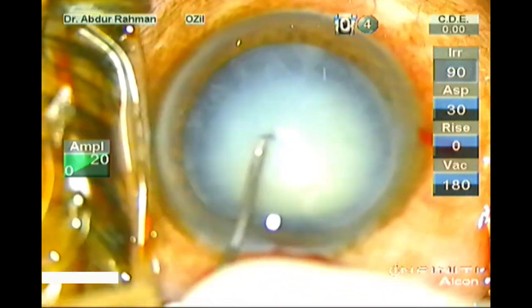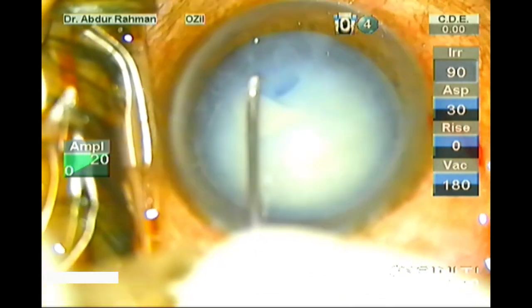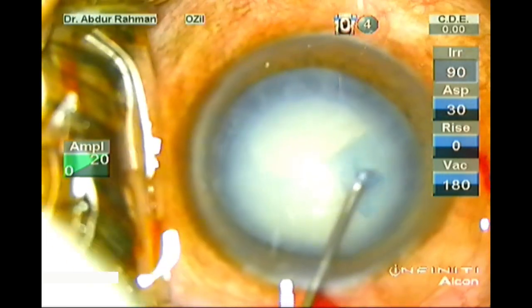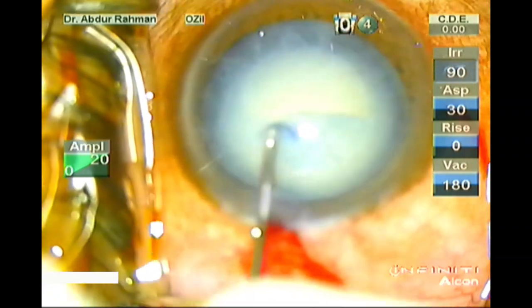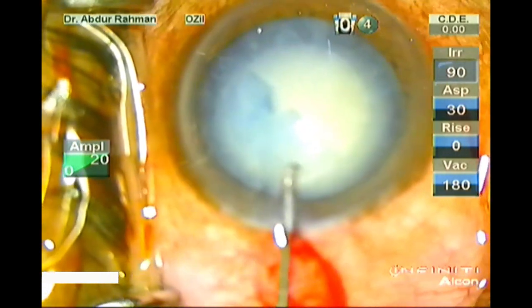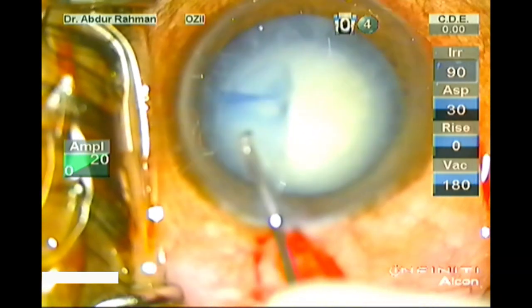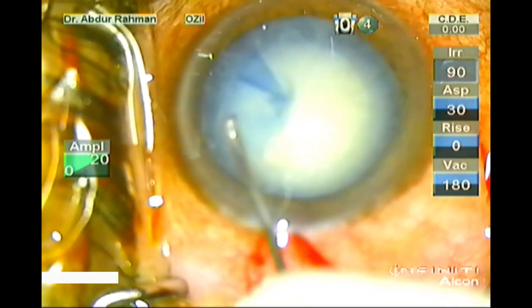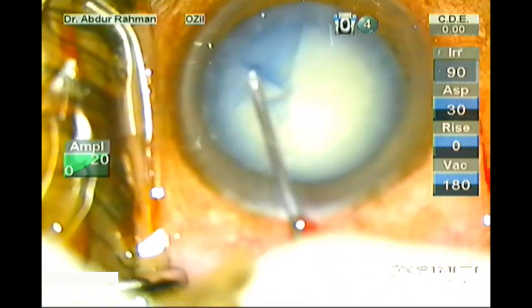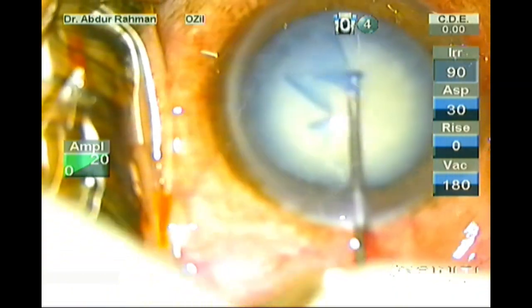Now commence with the creation of a continuous curvilinear capsulorrhexis of 5.5 mm. See how I lay the flap flat on the intact anterior capsule and guide the flap in a centripetal manner to complete a continuous curvilinear capsulorrhexis. Yes, it is completed.